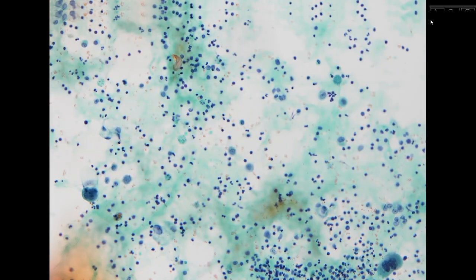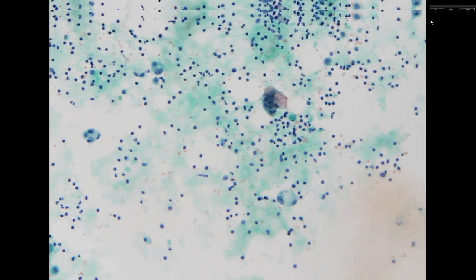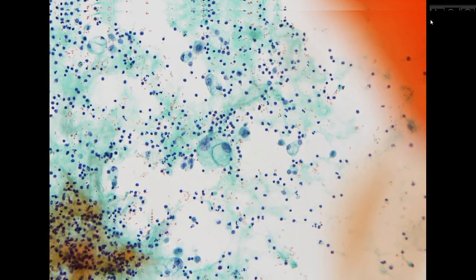The patient does have a past history of cholangial adenocarcinoma, which is a primary intrahepatic adenocarcinoma of the biliary tract. So the morphology is consistent with the history of cholangiocarcinoma. We will send this out as positive for adenocarcinoma, compatible with the history of cholangiocarcinoma.